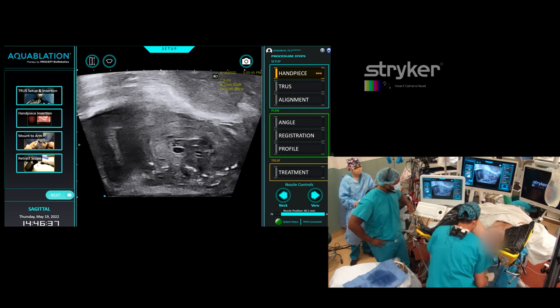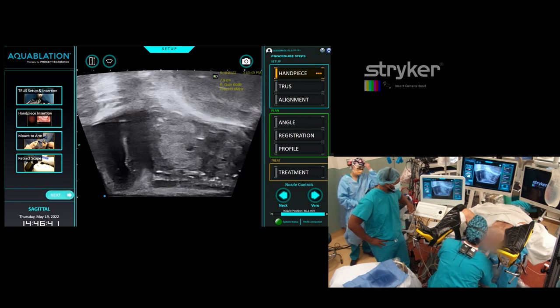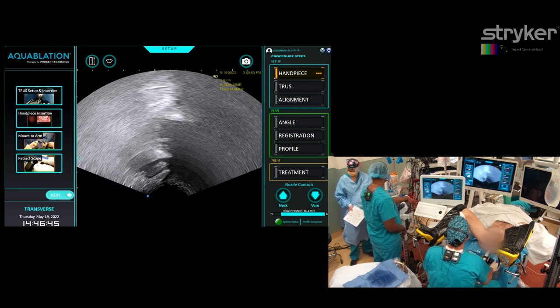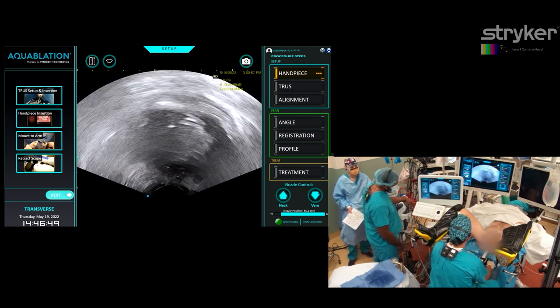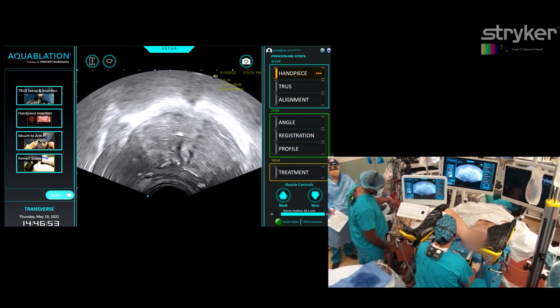Can you go in a little bit further? I'm kind of hubbed it — maxed out? I can go a little more. Let's hit the other view. There's the median lobe right there. I'm going to center this a little better here.